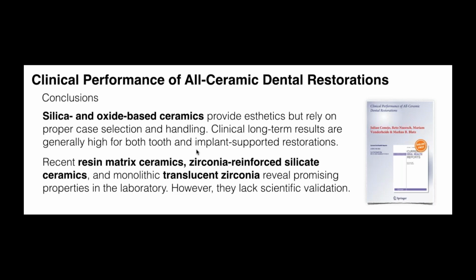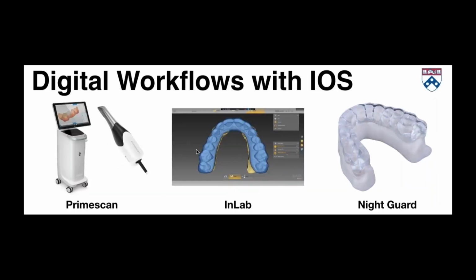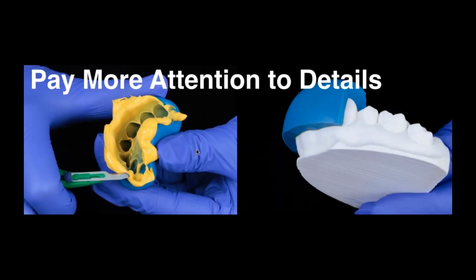So I expect to share all that knowledge or content and publications we've done through the years on zirconia very, very soon. Okay, so remember, make sure you scan, make sure you provide some protection for any type of restoration, even if we're talking about porcelain fused to metal, PFM, or any type of monolithic ceramic restorations.